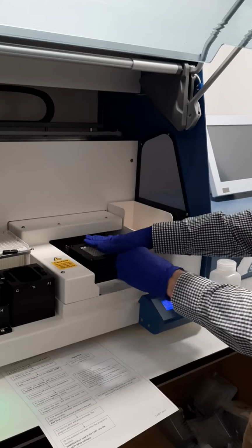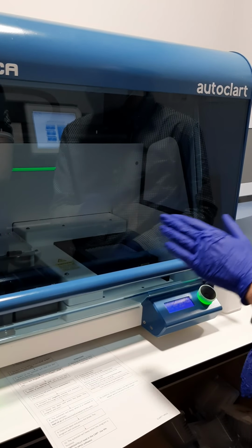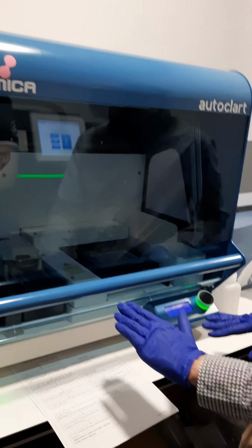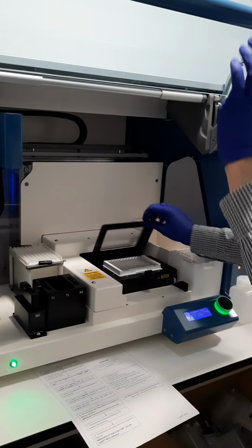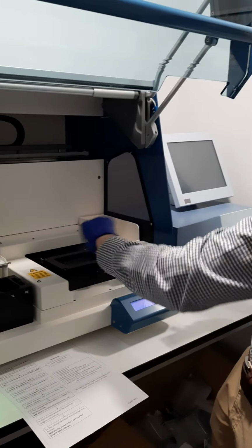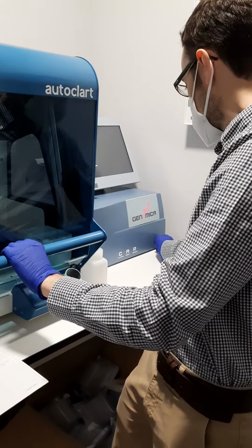We place it again in this, we close, and it's going to add the rest of the reagents until the end. Once it's finished, we are going to take out this plate, and we are going to read here. We can switch on also this one.